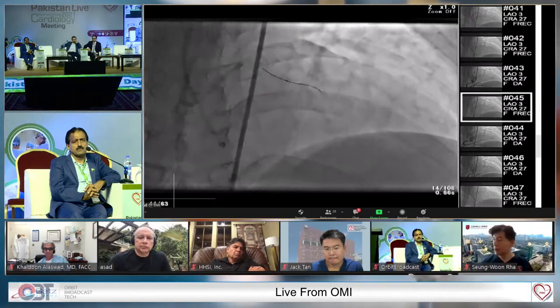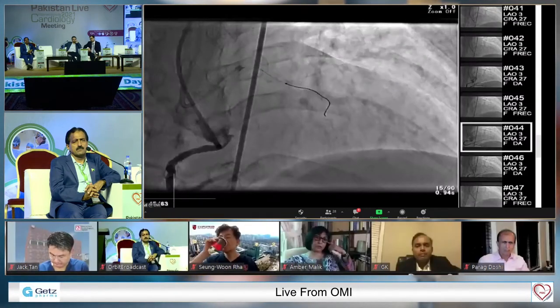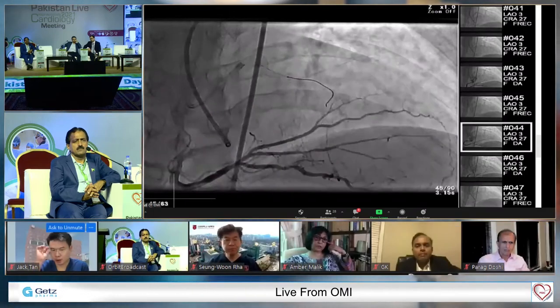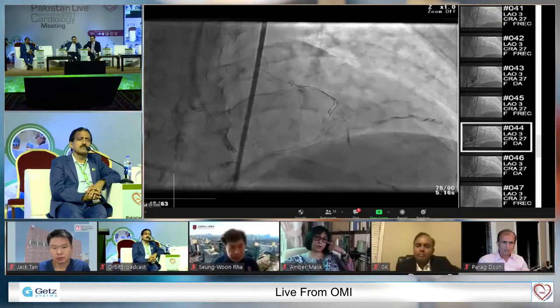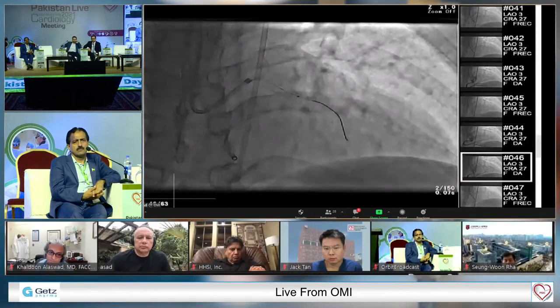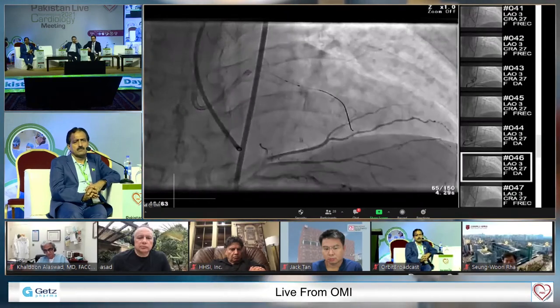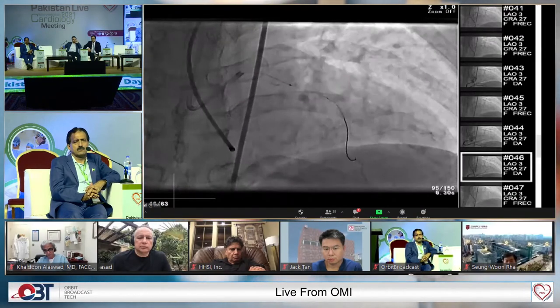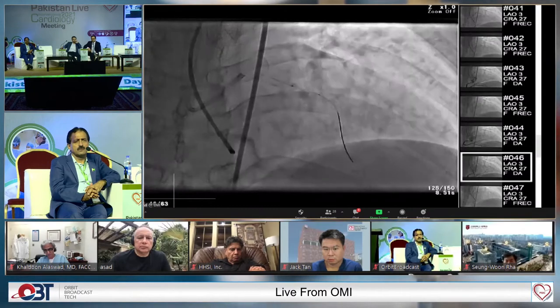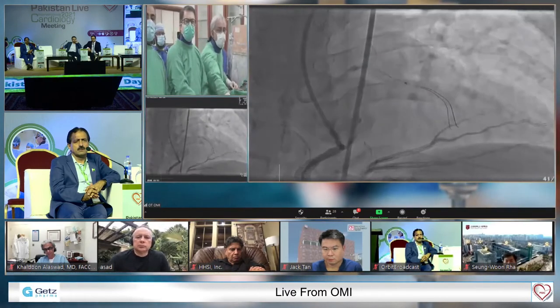Okay. And so you can see we made some progress. Next please. We took another injection. Next please. Yeah, keep going. You can see that we're across the lesion, but we're into a side branch. Next please. And we redirected that, pulled it back, and we seem to have gone into the main vessel. And once we got in the main vessel, I think the bulk of the work was behind us.